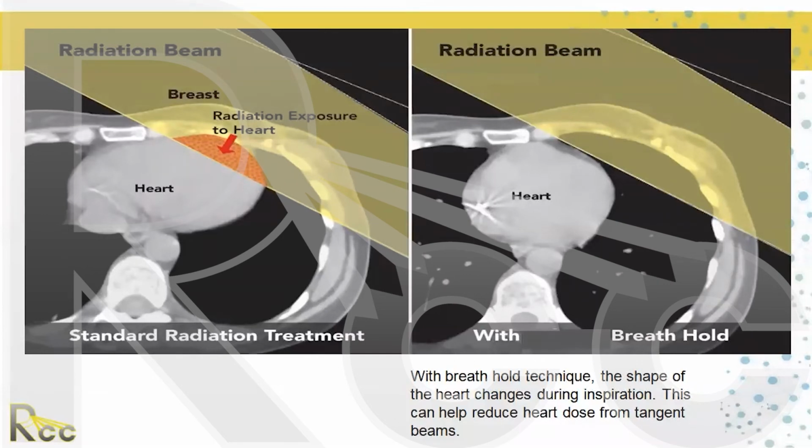You're dose limited with cobalt because of dose to the normal surrounding healthy tissue, especially the eyes, especially the spinal cord, especially, say, the parotid glands, if you're treating in that area. Dose limit is always a consideration. If you can deliver the same amount of dose or even higher dose while sparing normal surrounding tissue, you're going to get better tumor control and you're going to get less side effects.